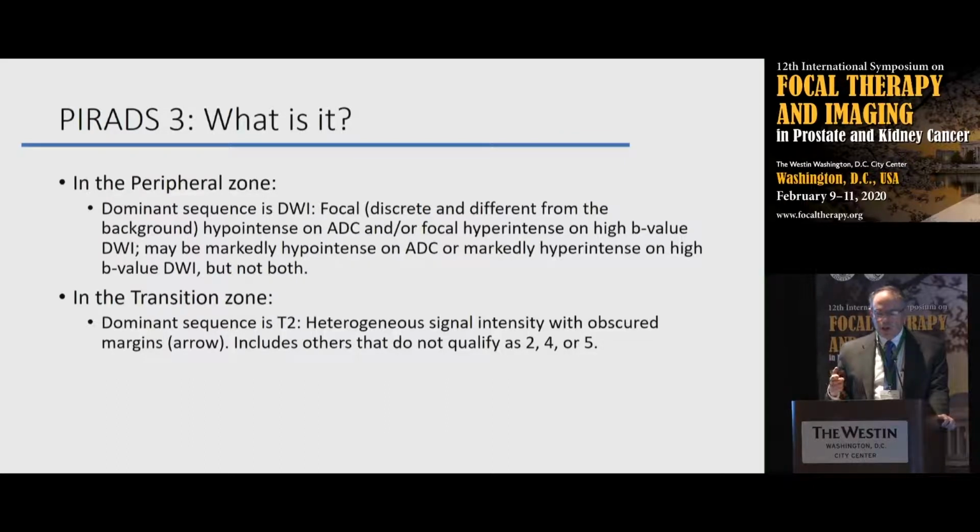And whenever you see a definition that is this long, you know you're going to have a lot of subjectivity in the outcome. Different viewers are going to view this very differently. And I won't go over the transition zone definition, but it's similarly vague and subjective.